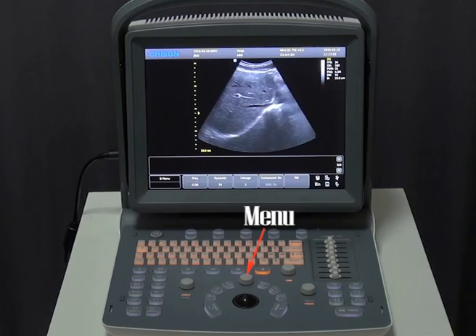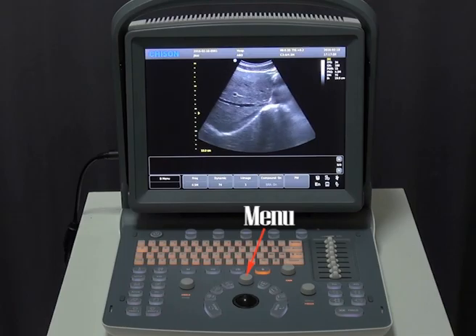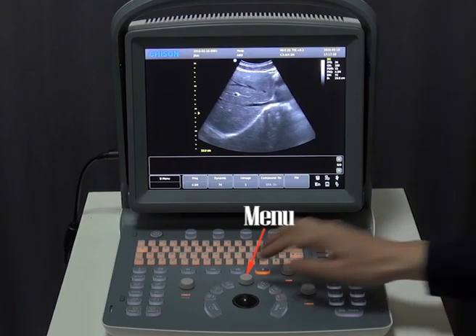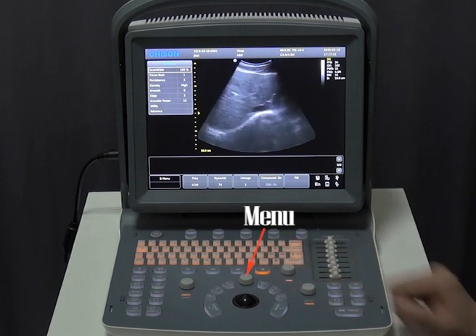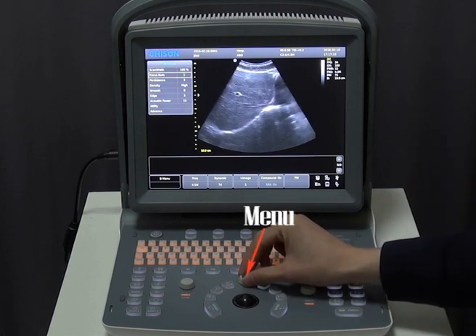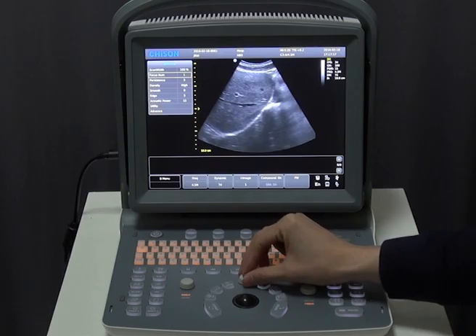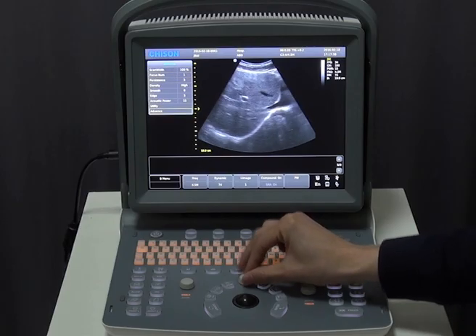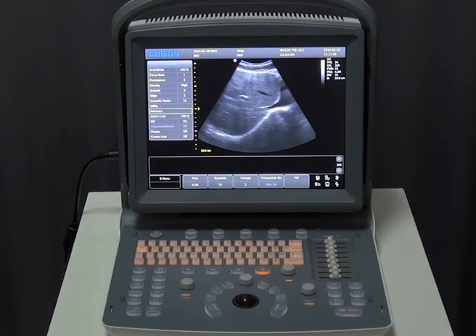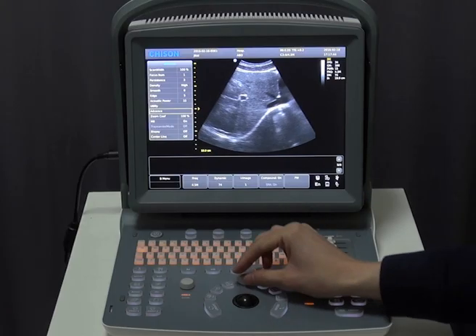We have some secondary image optimization controls by pushing down this menu button, such as focus number, persistence, density, and so on. After you click Advance, you can see zoom coef, multi-beam, biopsy, and center line.